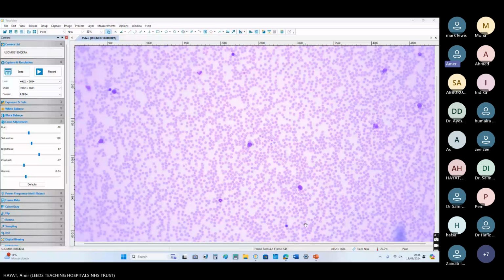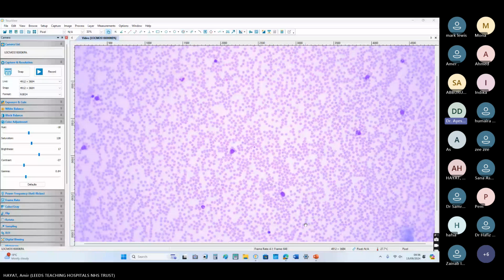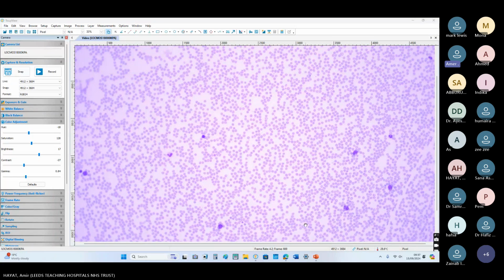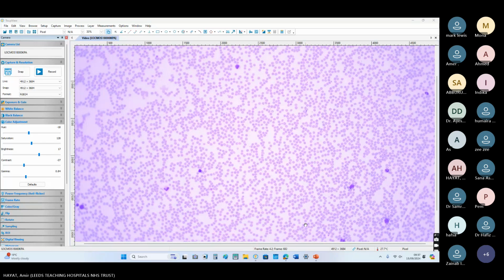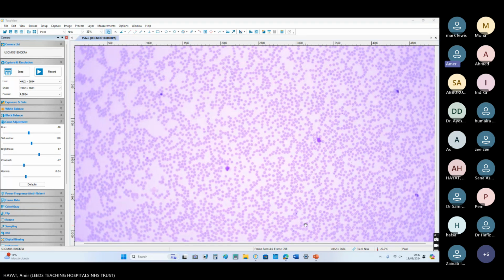Anyone from the lab side who wants to comment on it first and then refer to the clinical hematologist? Sir, there are spherocytes. Along with that, a few atypical lymphocytes are seen. NRBC is there, and the lymphocyte has abundant cytoplasm. Can you please magnify it further? Okay, I will go through the blood film first at power 10 to give you an overview of the film.